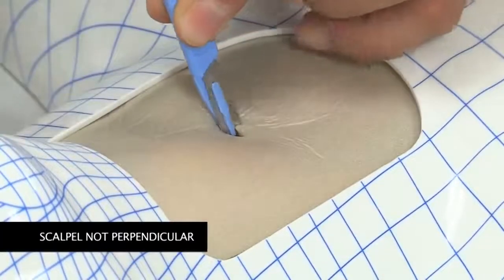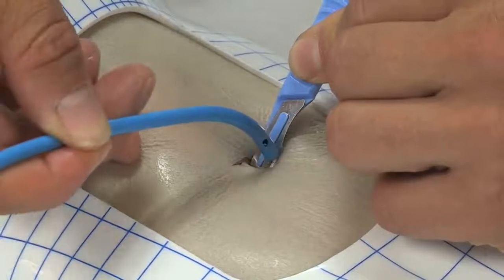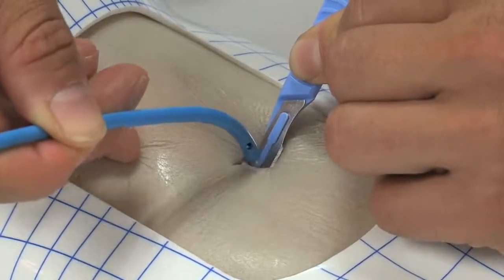After the stab incision, holding the scalpel in a not-perpendicular fashion can obstruct the opening, and make the insertion of the bougie difficult or impossible.